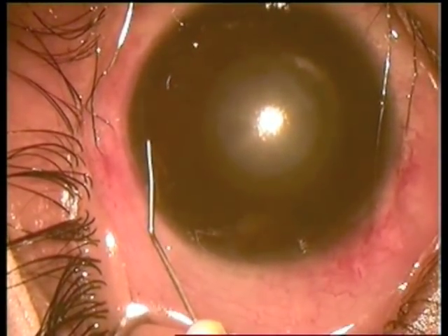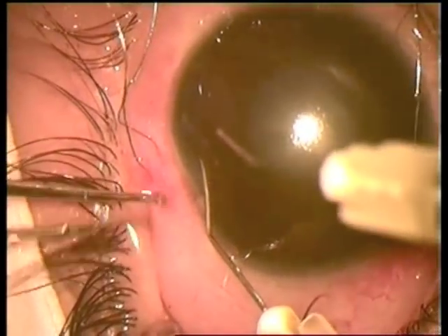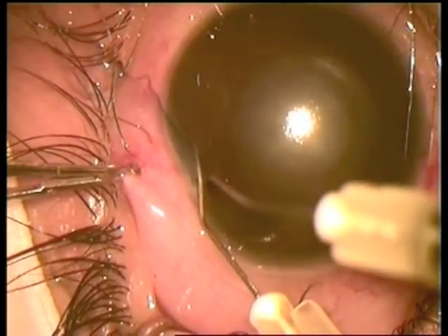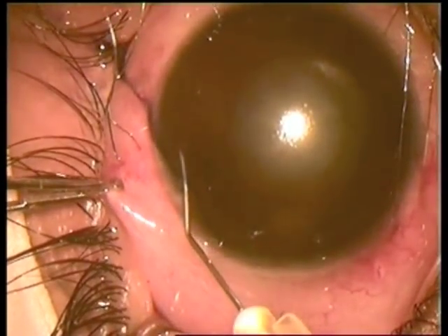Trying to deepen the anterior chamber, but the pressure increases. The cannula is pressed and a lot of fluid comes out from under the iris.